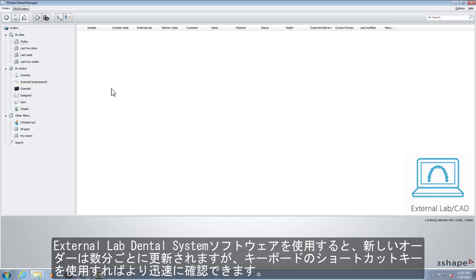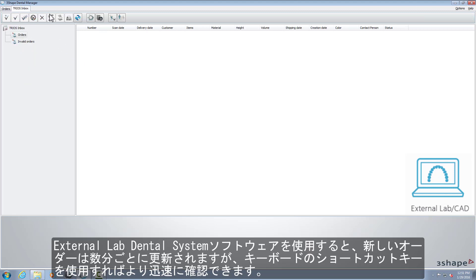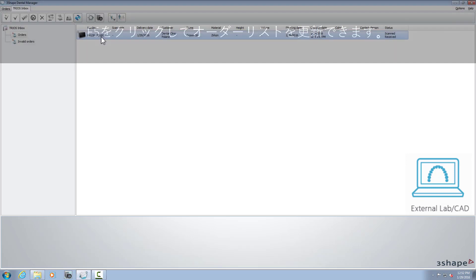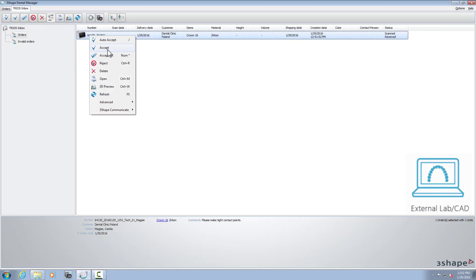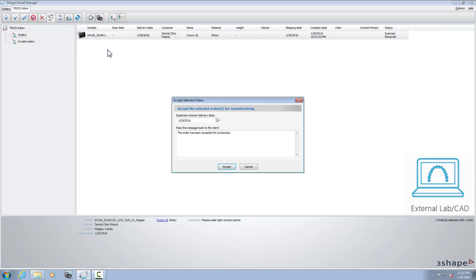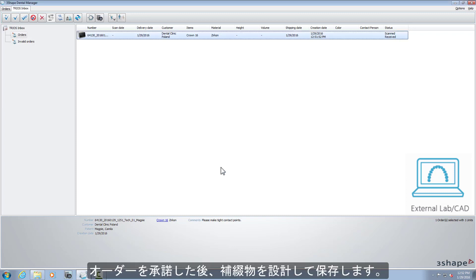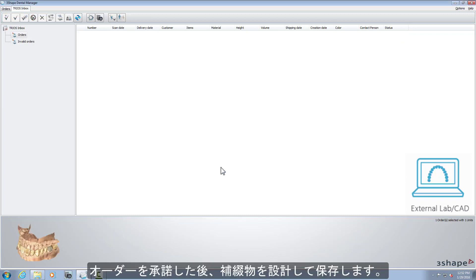With the external lab dental system software, new orders will be refreshed every few minutes, but it can be checked faster with the help of the shortcut key on your keyboard. After accepting the order, design the restoration and save it.